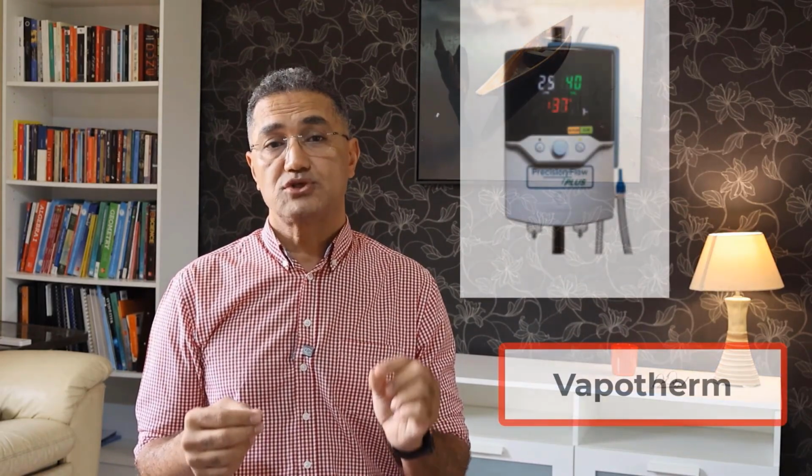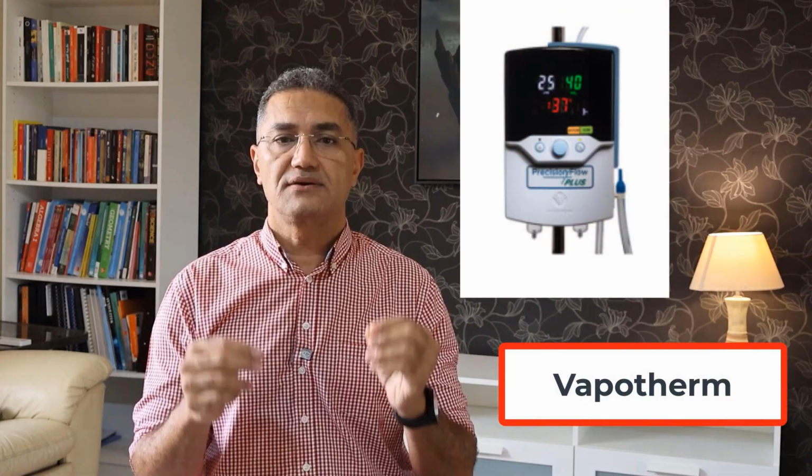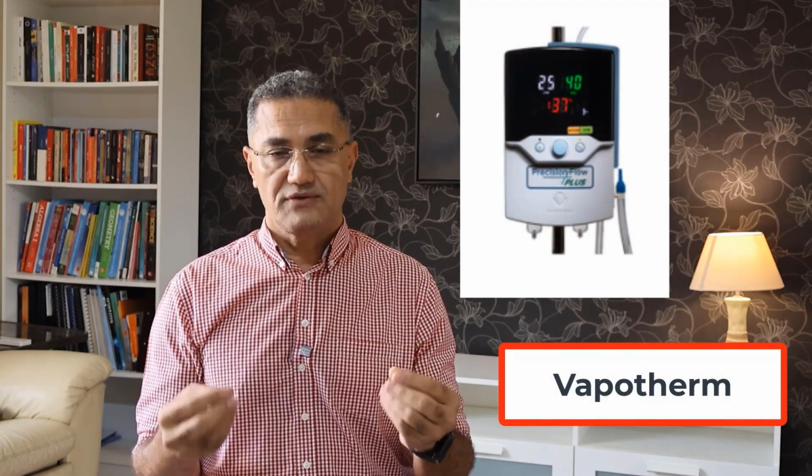At the end, I will tell you about something very important called the interface. The interface is the part that is applied to patients to provide respiratory assistance. But I will tell you about it after talking about the machines first. Some of you might ask, what is the Vapotherm? Because we see it, and to understand the Vapotherm, we need to know something extremely important. It's very important to remember, know, and understand it.